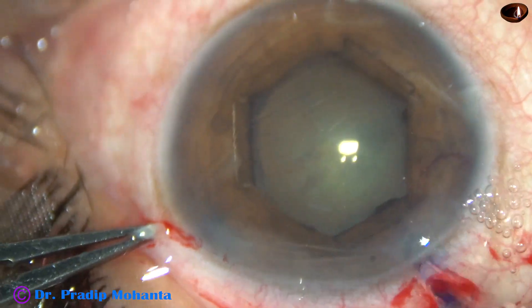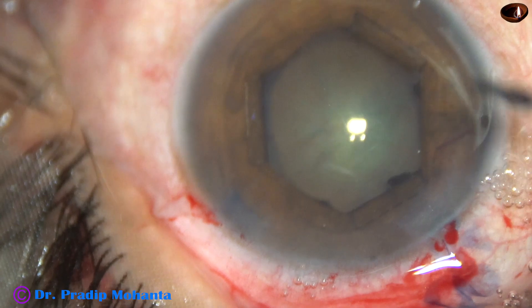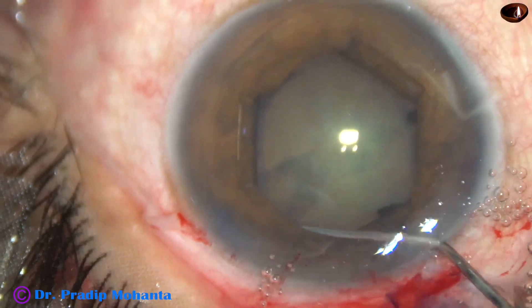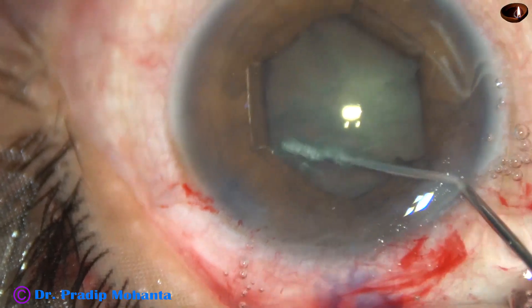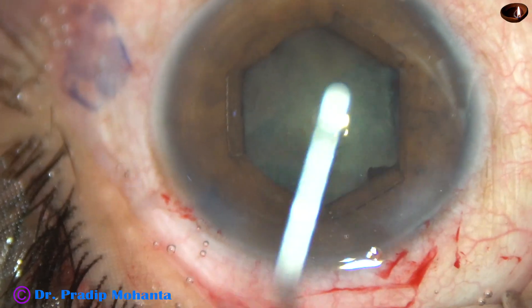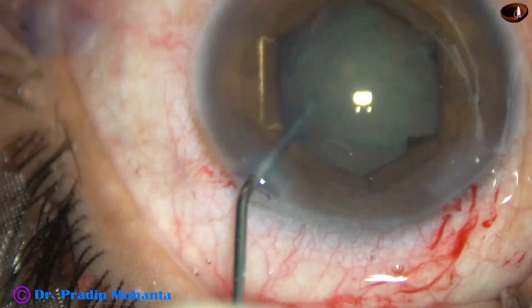We can see that the cataract is not hard — it is a soft cataract. Nucleus sclerosis is grade 2 or grade 2+. This is hydrodissection. BSS is passed just under the anterior capsular rim. The nucleus floats and is tapped. Fluid is injected at multiple areas. The nucleus has been freed and is now rotating.